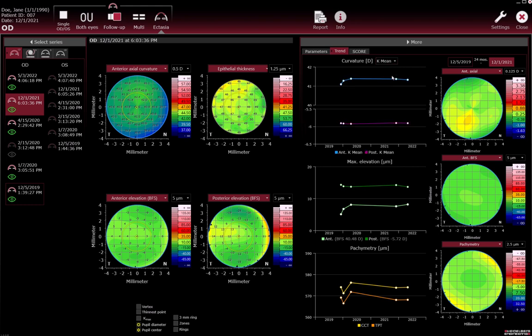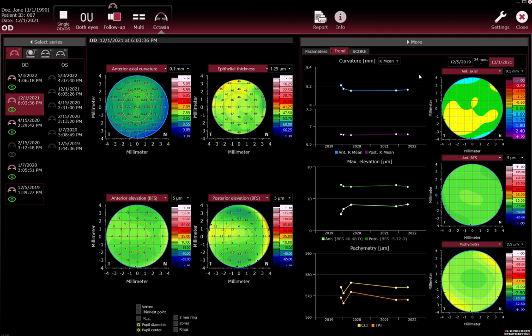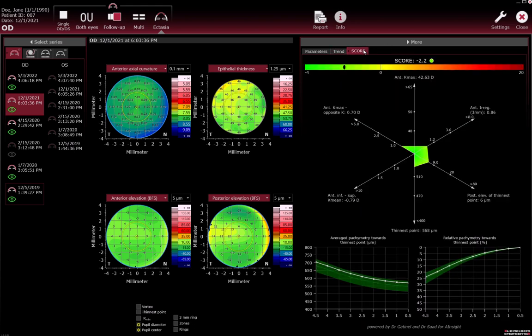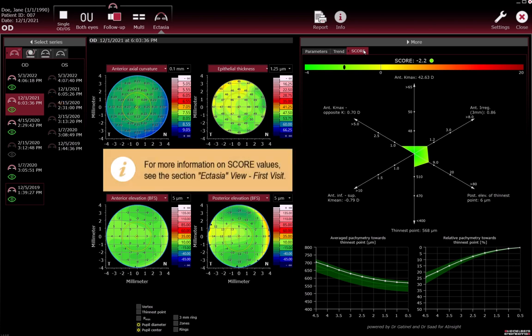To switch the unit of measure in the curvature trend analysis graph and the curvature-specific colour maps, right-click anywhere and select the unit of measure from the context menu. To display the exact values of an examination illustrated in the trend analysis graphs, hover the mouse pointer over the corresponding dot on the curve. In the Score tab, you see the analysis for the examination highlighted in red in the Select Series section. For more information, watch Ectasia view first visit.